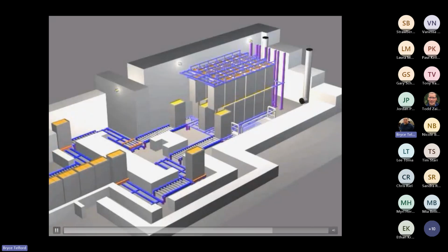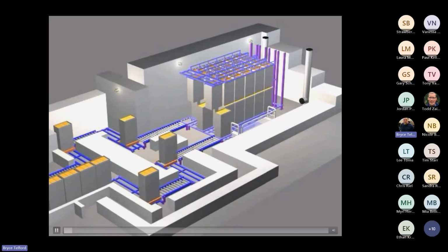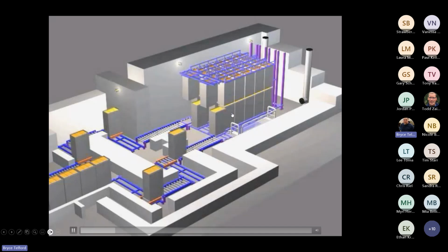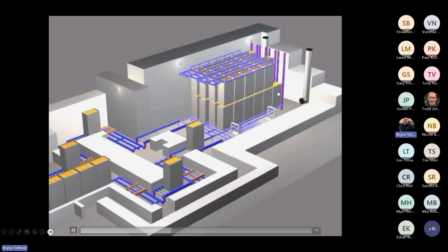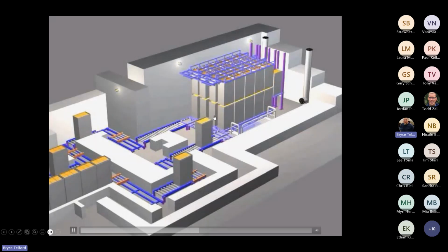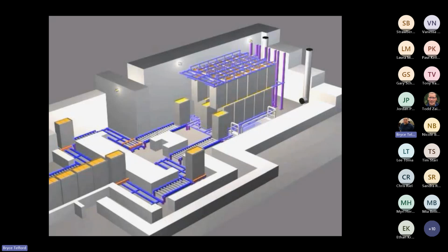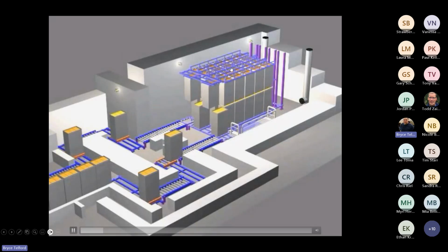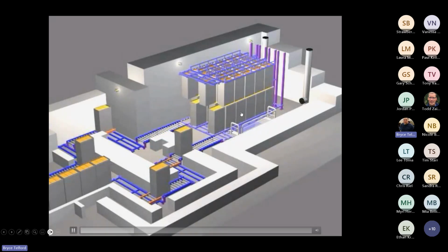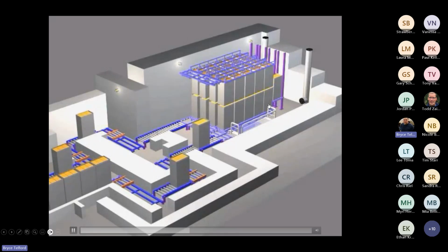Now, something to be considerate of is my product, if I'm loading it into the chamber, can't go any faster than the product in front of it. So if I need less dose, then that's going to be a problem because I need to go through the chamber faster, but I can't go through the chamber any faster than the product in front of me. So there's going to be some different cycles. Similarly, if I have a product that needs a really high dose, I can't just sit and dwell around forever and have a low dose product coming behind me. I have two different timing sets.